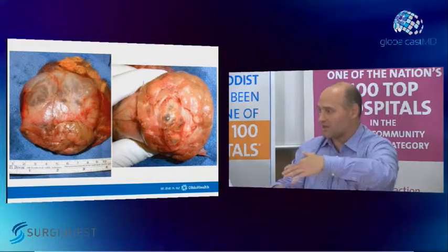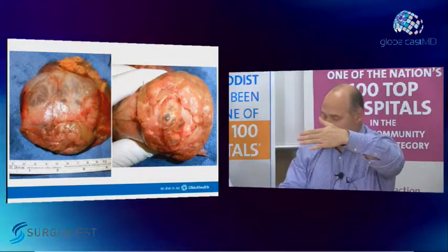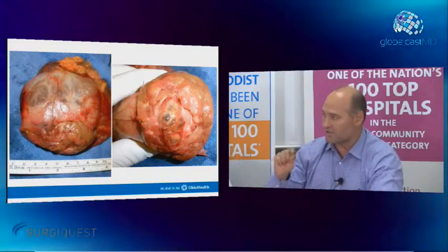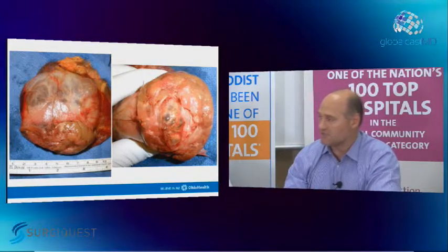So when you saw Ronney today putting his hand up on the tumor, cyst side down, well, when you do that against a cystic tumor, that's a problem. So you need a thicker rind of parenchyma to keep yourself out of trouble in that regard.